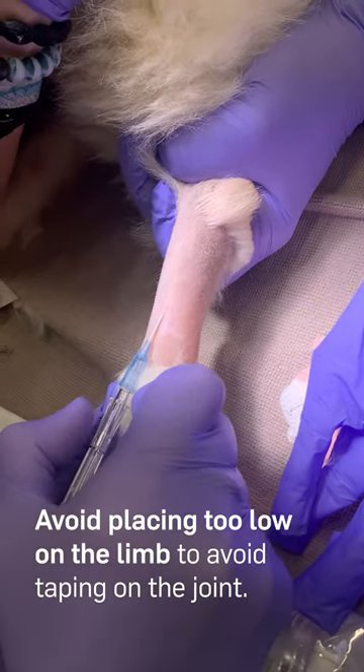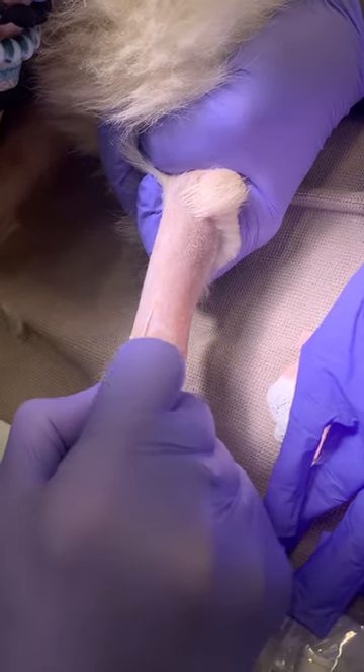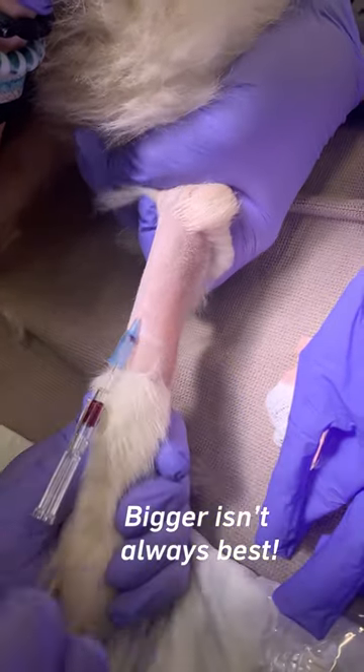Avoid placing too low on the limb whenever possible to avoid having to tape on the joint. Remember, bigger isn't always best.